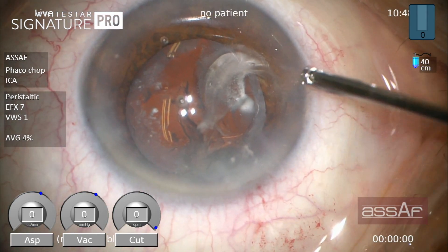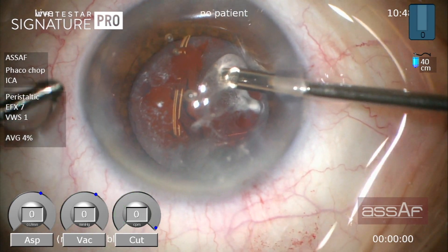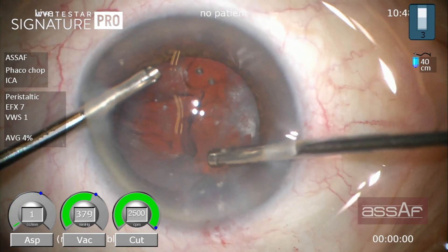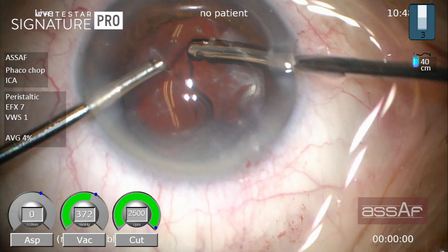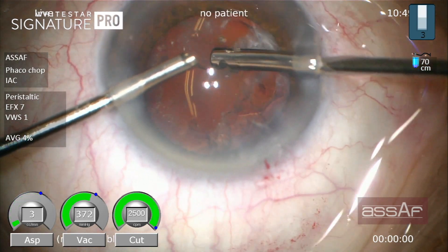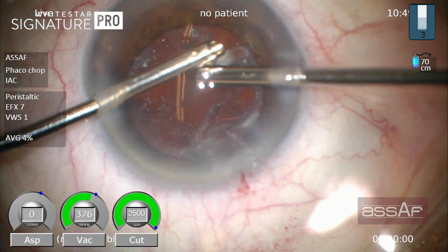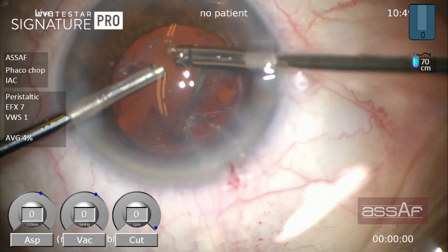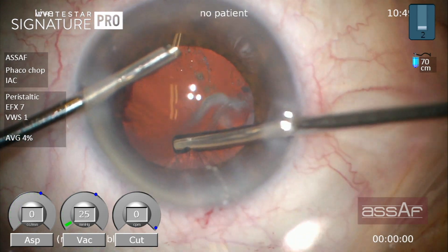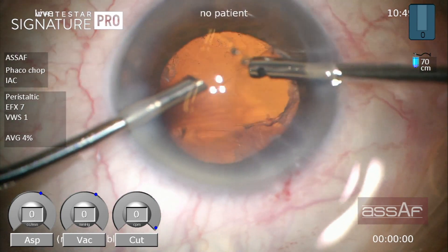This is the time to move forward with anterior vitrectomy using the limbal approach. I started by using the highest cutting rate; the vitrectomy mode here is irrigation-cut-aspiration. I'm trying to clear all the vitreous bands already prolapsed inside the anterior chamber before addressing the remaining cortical fibers. After doing anterior vitrectomy, I'm moving forward with irrigation-aspiration-cut — so we can switch the vitrectomy settings between irrigation-cut-aspiration and irrigation-aspiration-cut, with the cutting ability activated if vitreous prolapses.